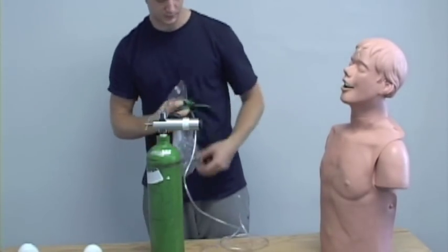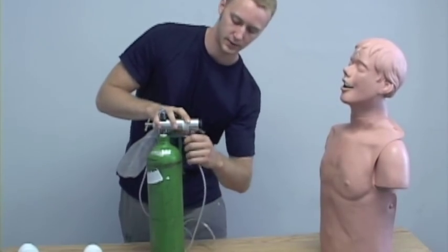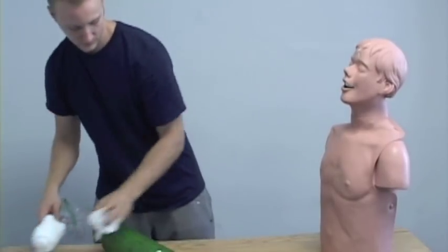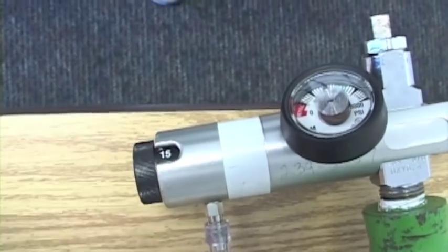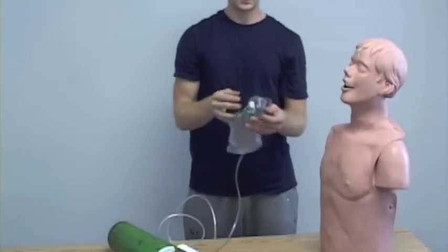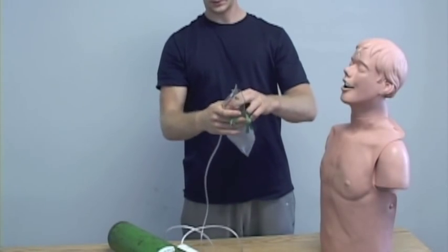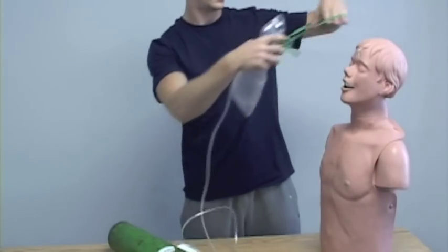Now I'm going to attach the non-rebreather to the tank. Set the tank down. Set it to 15. Make sure the bag is clear. Fill the bag. Apply to the patient.